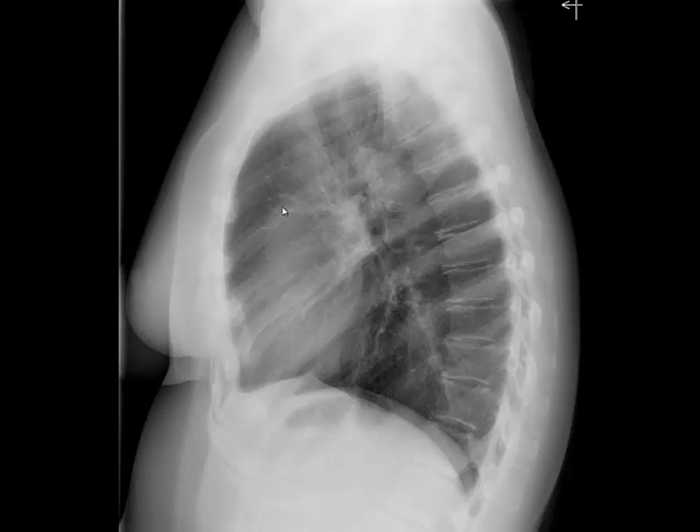Then I assess the aortic arch and the descending aorta as much as possible, and then I evaluate the lung parenchyma. Normally in a lateral chest radiograph, the anterior superior aspect in the retrosternal region should show good aeration of the lung parenchyma, as well as the posterior inferior aspect, and these regions should be well aerated.